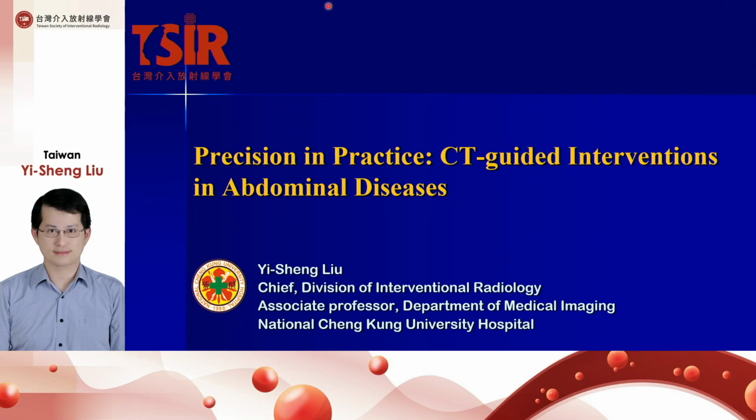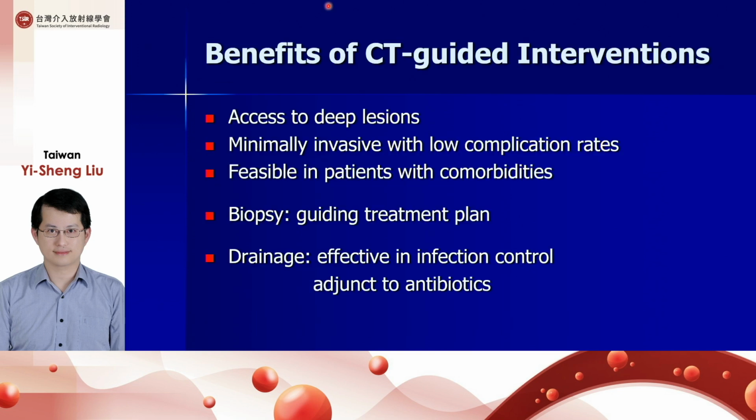My topic is CT-guided intervention in abdominal disease. In general, the benefits of CT-guided interventions include that it can access deep lesions and is minimally invasive, with low complication rates, and is feasible in patients with comorbidities. In clinical practice, CT-guided biopsy could guide a treatment plan, and CT-guided drainage is effective in infection control.